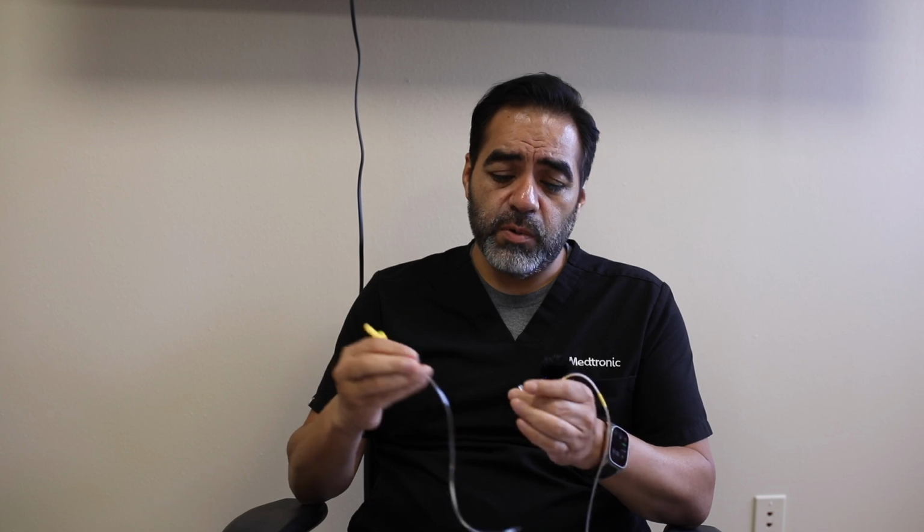Another point that I always bring up to help you troubleshoot this and help your filter last longer: if you're giving a nebulizer or lavage suctioning, I recommend you unplug our filter from the Mindray module. This will turn the motor off, so it will not be pulling our breath anymore. What ends up happening otherwise is that water from the nebulizer will suck into the filter really quickly, and it's going to clog your filter faster than normal.